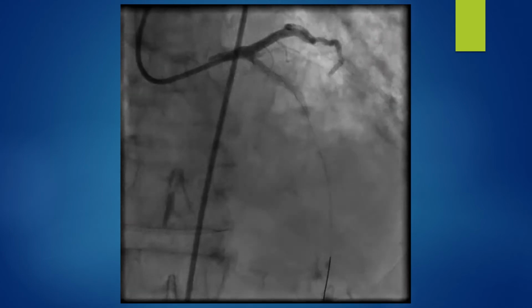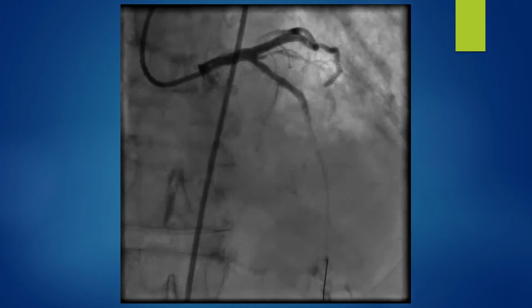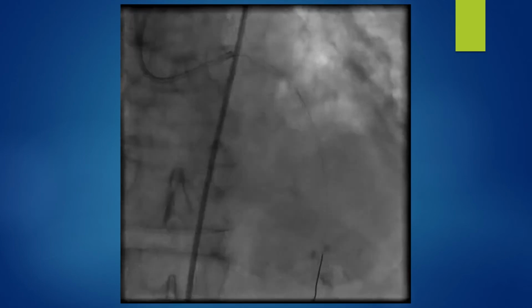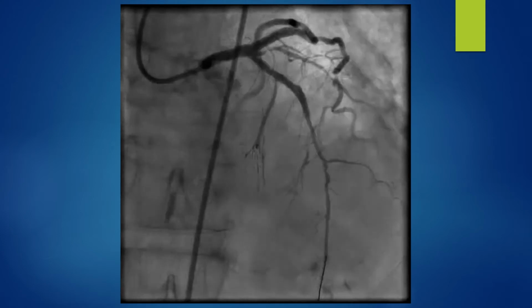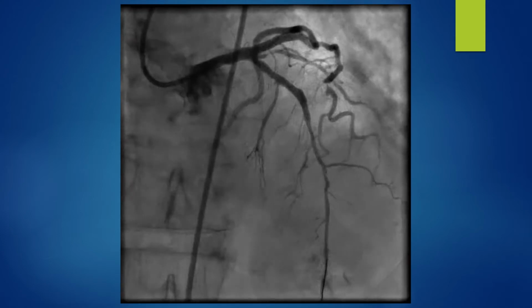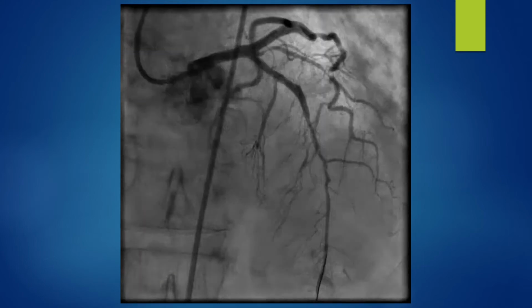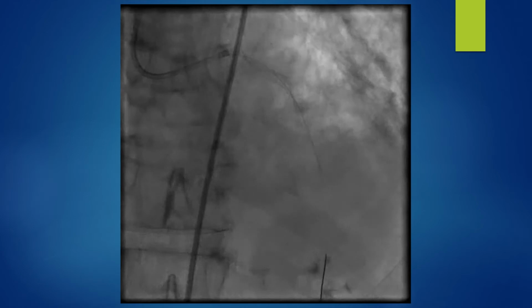The issue is sometimes when you post-dilate more in a calcified vessel, you are risking perforation. So therefore I just left it alone. Otherwise the stent looks very well apposed. Proximally there is mild disease all the way up to the ostium of the LAD, and I just left it alone.